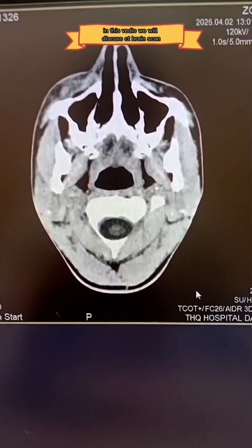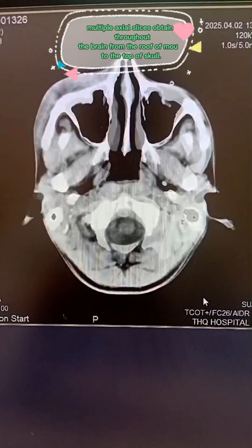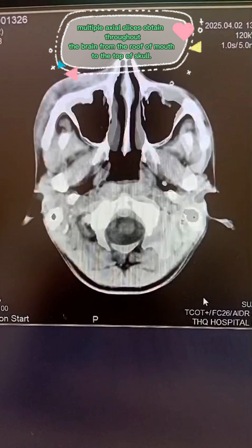In this video, we will discuss CT brain scan — multiple axial slices obtained throughout the brain from the roof of mouth to the top of skull.